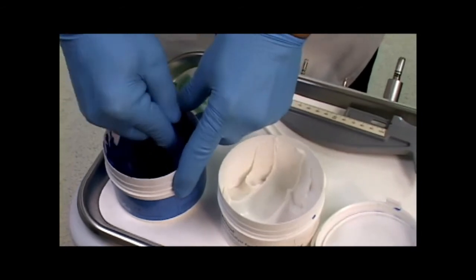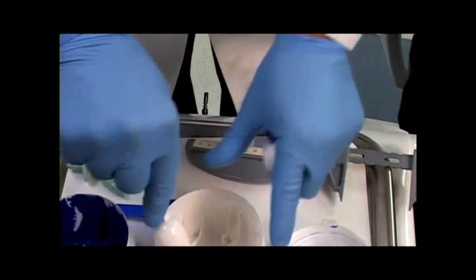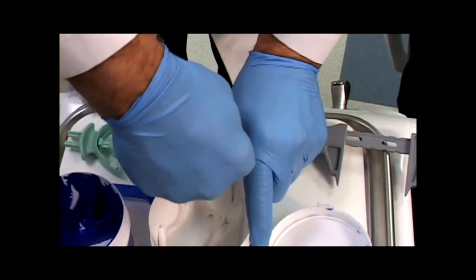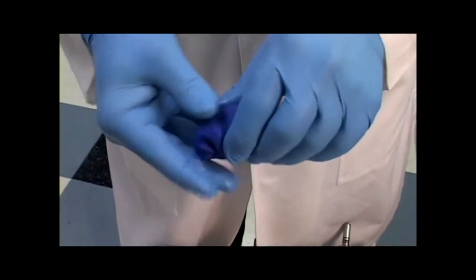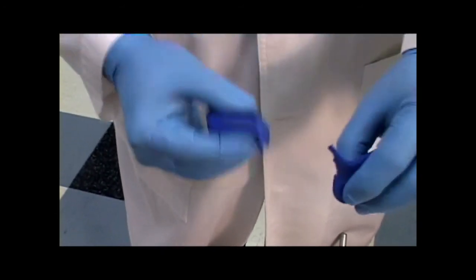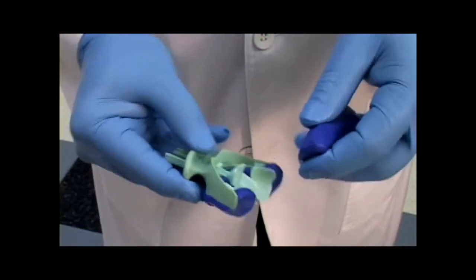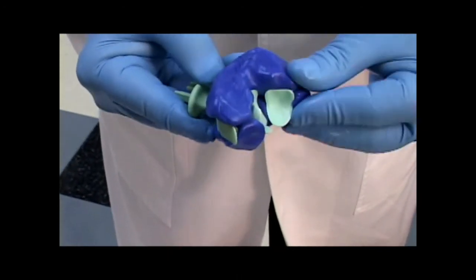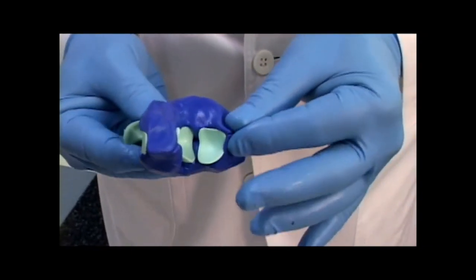Two scoops of virtual impression putty fast set are usually sufficient for most mouths. However, if there is severe resorption of the residual ridges, then three scoops might be necessary. The material is thoroughly kneaded until it is one homogeneous color. Separate the material into two sections and place them over the wings of the tray on both sides. By pinching the ends, it helps to secure the material into the tray. Now we are ready to approach our patient.